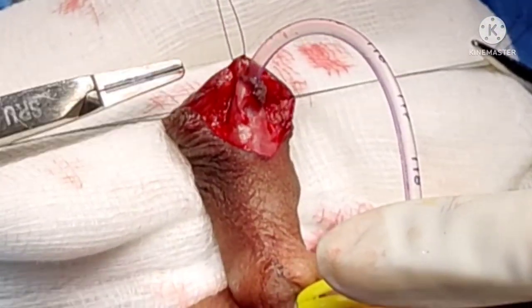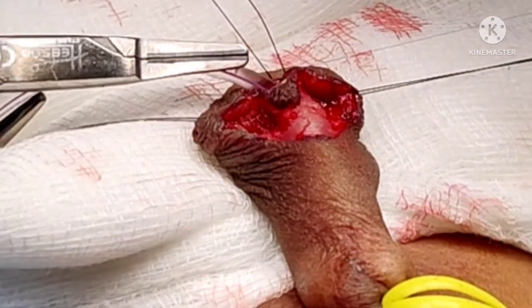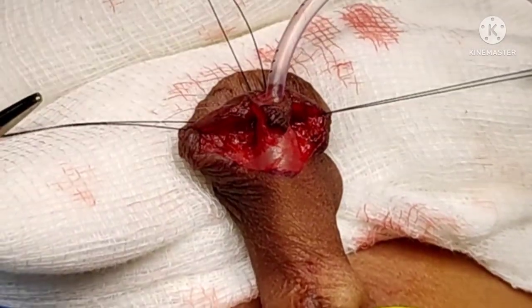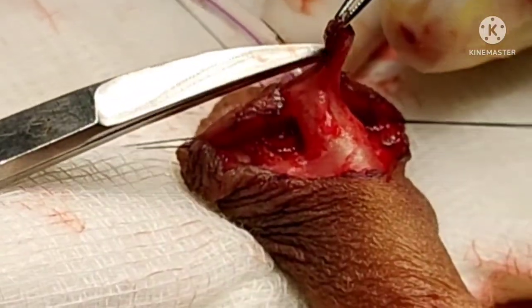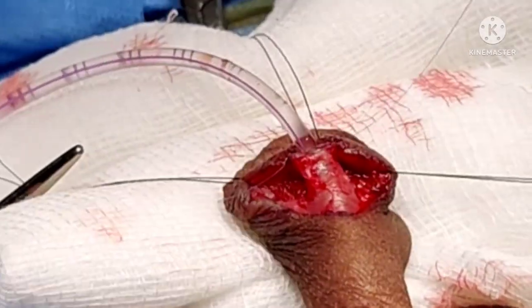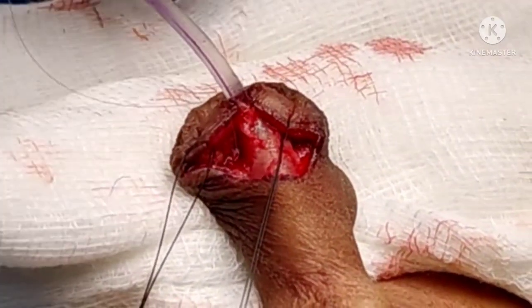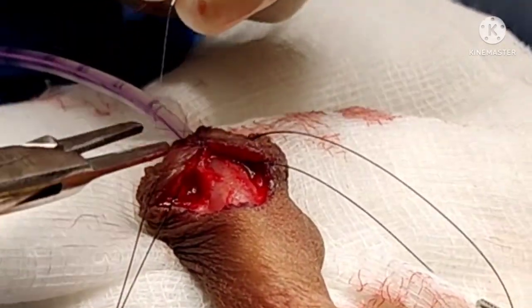Once this step is over, we are going to anchor the urethra at the tip of the glans where the meatus should be. This is done with interrupted 7-0 PDS sutures. You can see that the actual urethral mucosa is anastomosed. We then discard the tongue of skin which we were holding. Anchoring of the urethra to the new opening site continues, and anastomosis of the glans then follows.